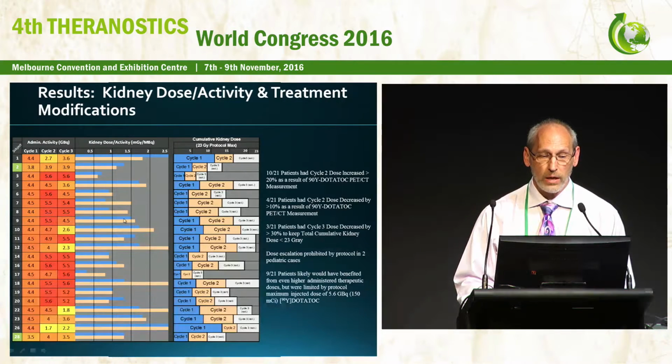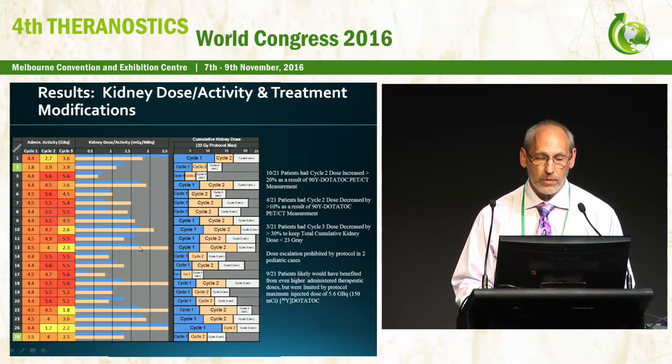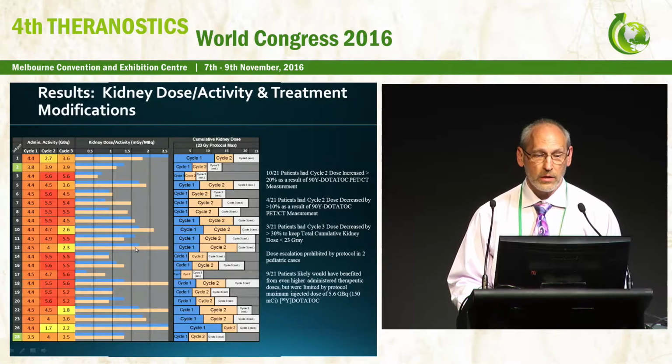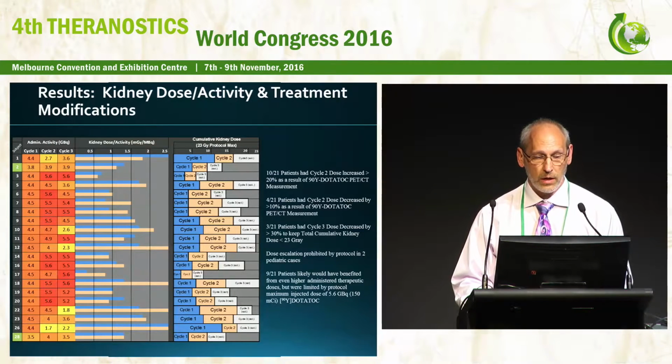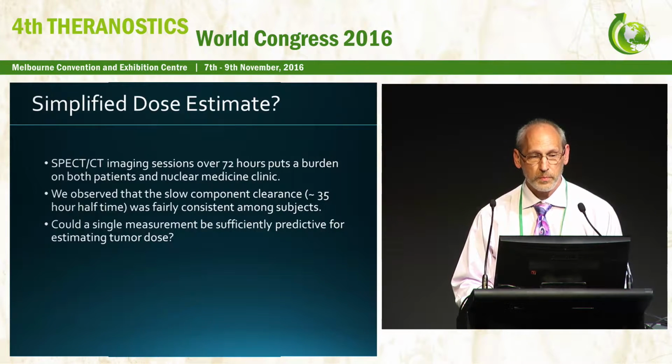We understand, I think, why they go up, the majority of the time because of the treatment effect. But the bottom line is, it is frequently different each time, so we do have to make measurements at each time point, each cycle, in order to get good results.